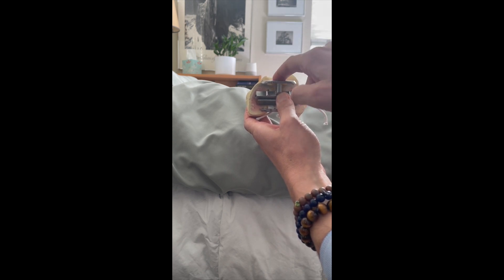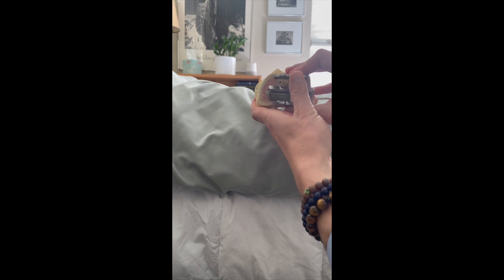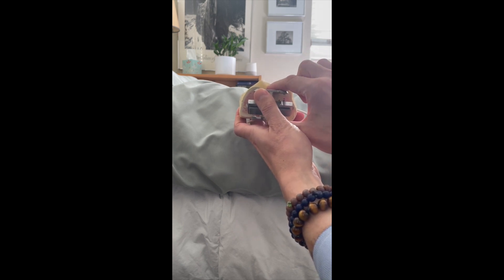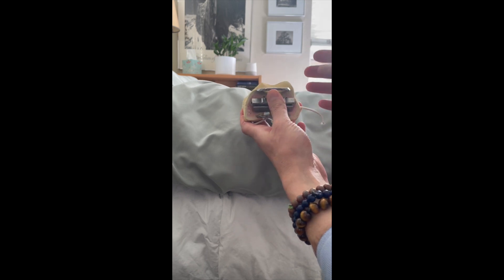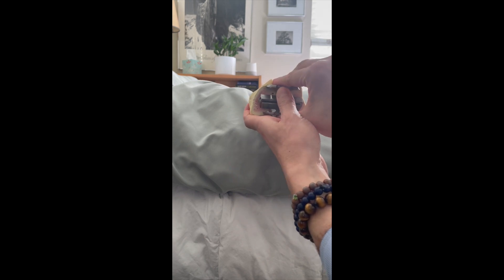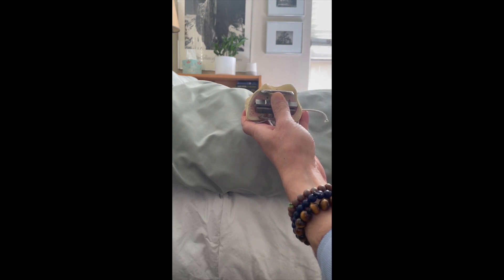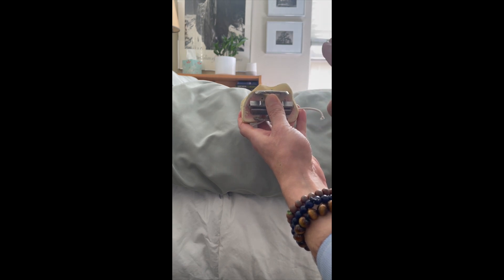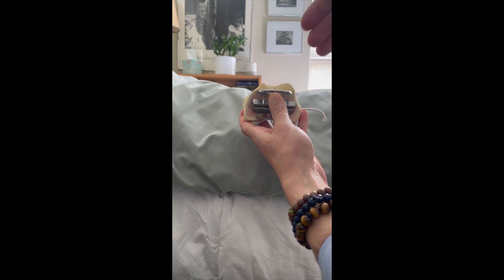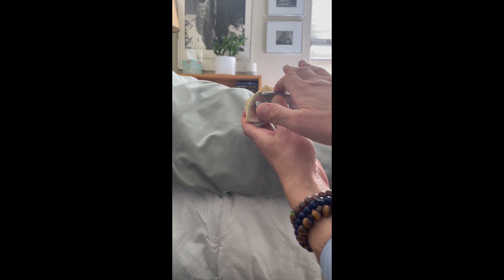The next thing I do is look at the top. At least in this system, my fingers should go over and I should have a little room where I can grab the back of the capture block. Usually for most knees, that means my cut is going to be appropriate. If the block is too low — where the cutting guide is flush with the bottom of the trochlea — that is an indication I am more likely going to notch. You might check it with an angel wing; some people always check it. Having these references where you can feel and confirm that feels about right is important. Certain systems cut up more — this cuts up seven degrees — and depending on how much you flexed your distal femur, you may be more or less likely to notch, so you want to have some reference there.